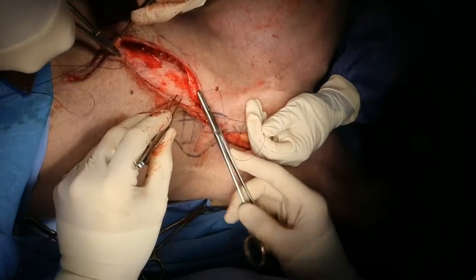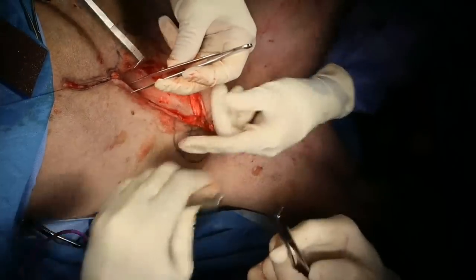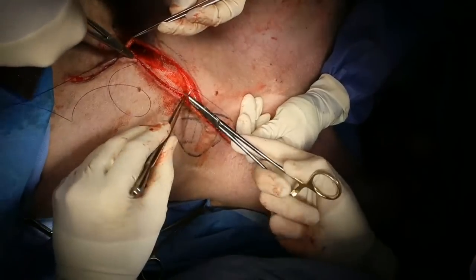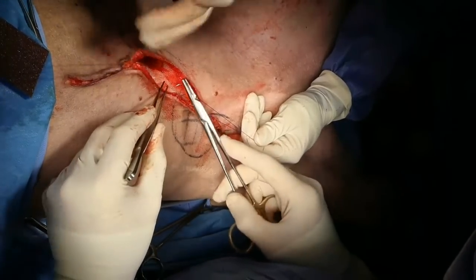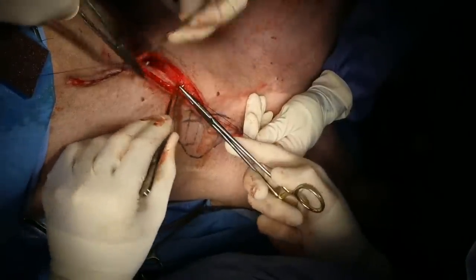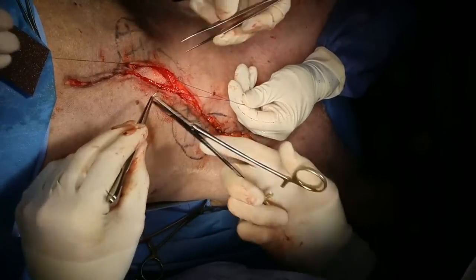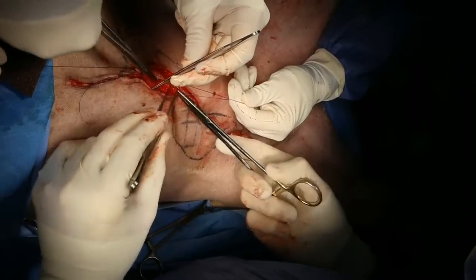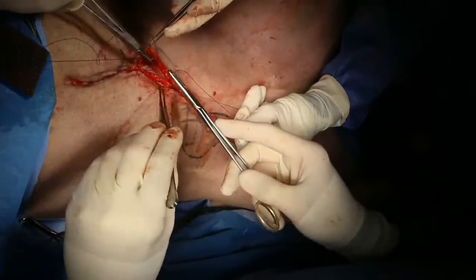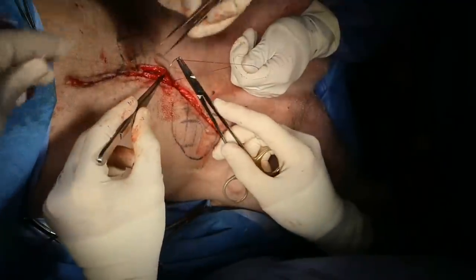Uday, as we're closing this, compared to your side, how far apart should my bites be on my side of this, given the shape of the wound? Good job. Do you know the answer to that, Mel? Yes. The question was, when there's a curve that's bigger on one side than on the other, how do we accommodate that for the spacing of our sutures, bites? And the answer is that on the bigger curvature, you want to put your bites farther apart.